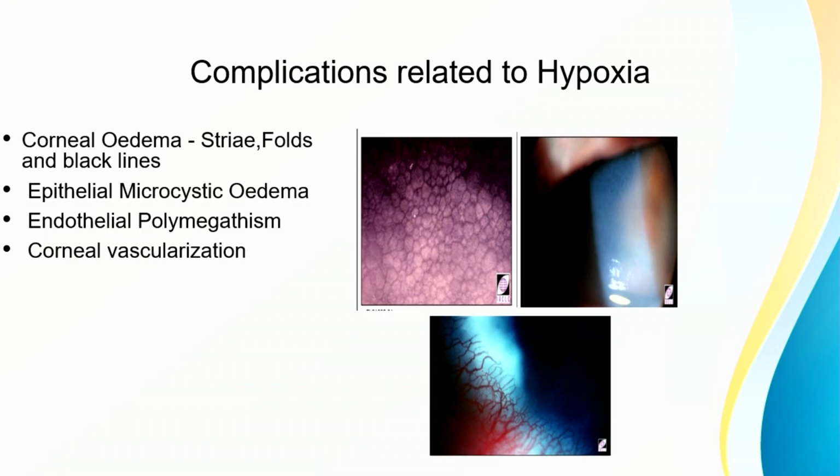There will be a tear exchange where oxygen can go to the cornea, and we can prevent more vascularization, or change to a high DK material. Any contact lens for that matter, soft, RGP or scleral lenses, we can shift them to the high DK material. Only one limitation in high DK material in terms of RGPs is that they can break when the patients are cleaning the lenses so hard, which they have to be told priorly.